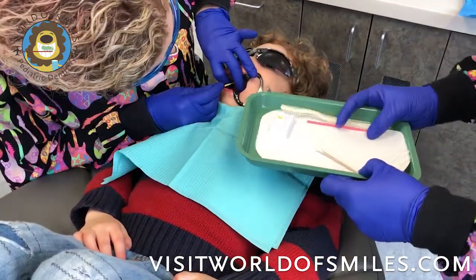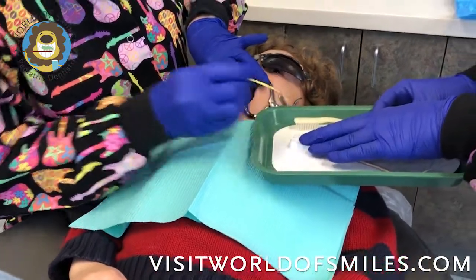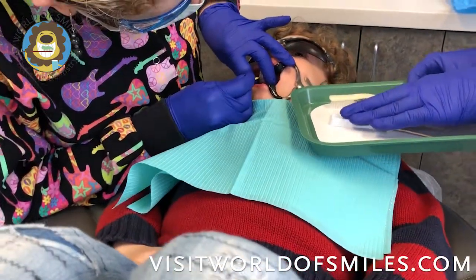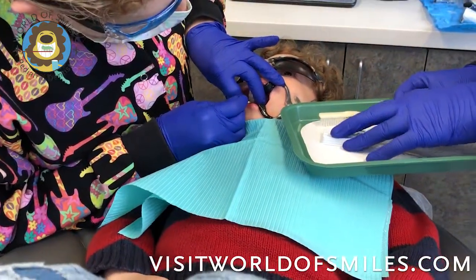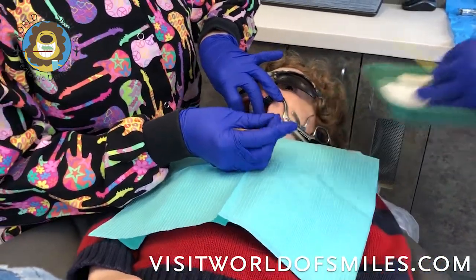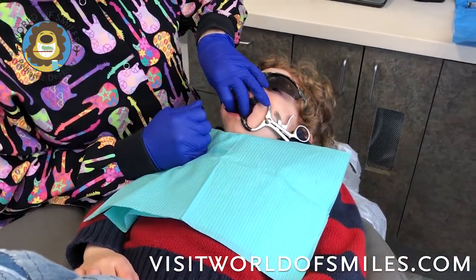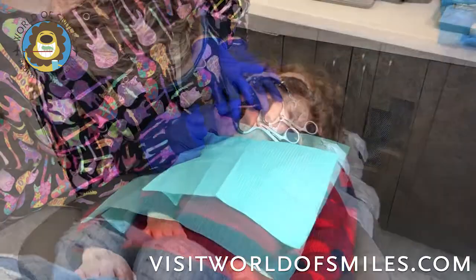We are applying the silver diamine fluoride now with the applicator tip. Make sure that it's nice and covered with the silver diamine fluoride liquid. Now we will wait one minute while the silver diamine fluoride penetrates the tooth.